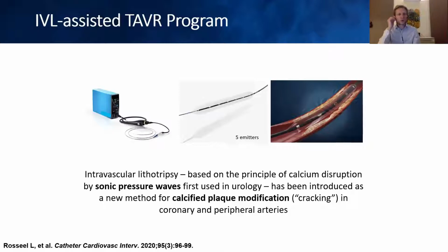So a small word about intravascular lithotripsy. This is based on the principle of calcium disruption by sonic pressure waves. And this was, of course, first used in urology, where calcium stones were fractured by this technology. But this has now also been introduced as a new methodology for calcified plaque modification, or you can say cracking the calcified plaque, in coronary but also peripheral arteries.